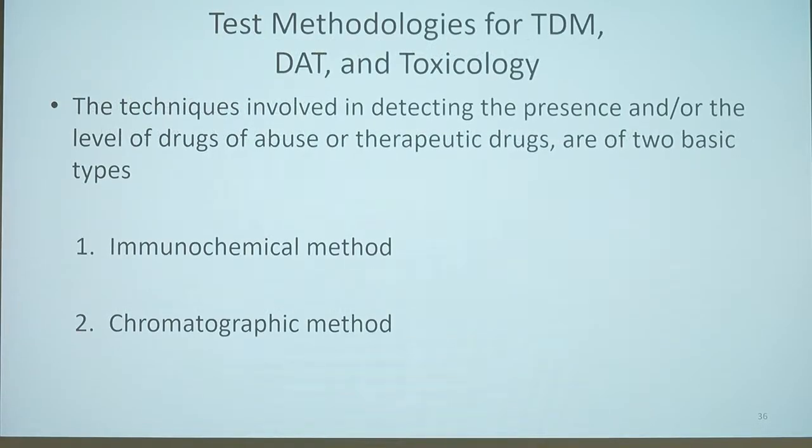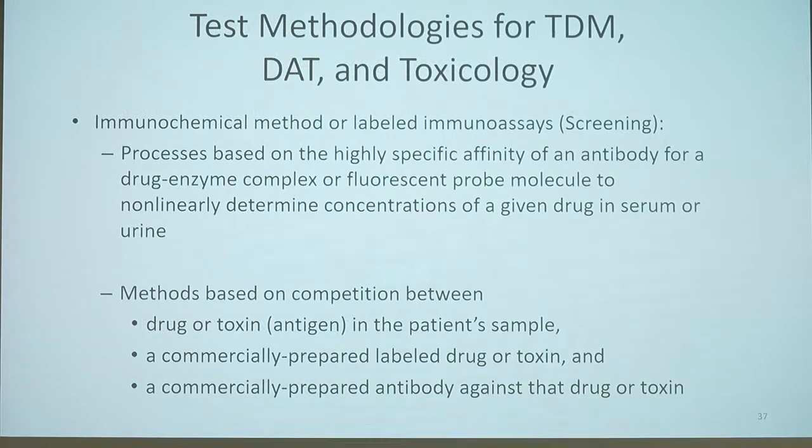The types of clinical assays used are immunochemical and chromatographic. They both are fast, and the immunoassay is more of a screening, and it uses antibody detection.